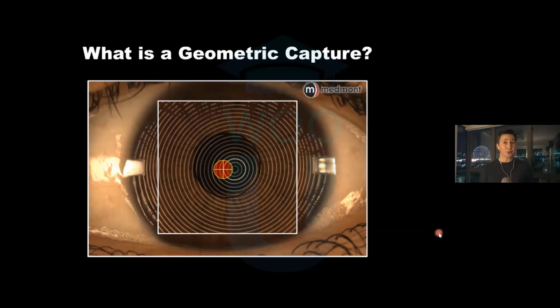You know, for one patient, it could be 1 ring, another, it could be 4 rings. Sometimes it's only a half a ring. It really depends, but what you want to do is ask the patient to look 1 or 2 rings over and then check whether that placido is best centered.